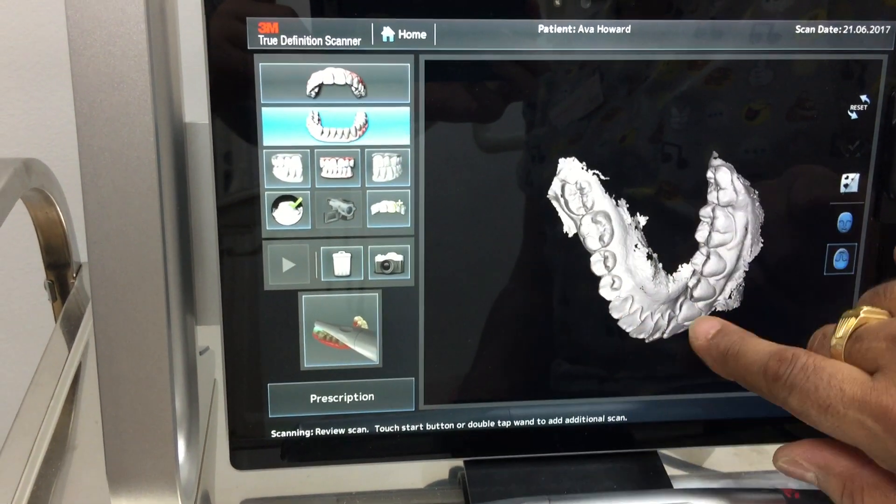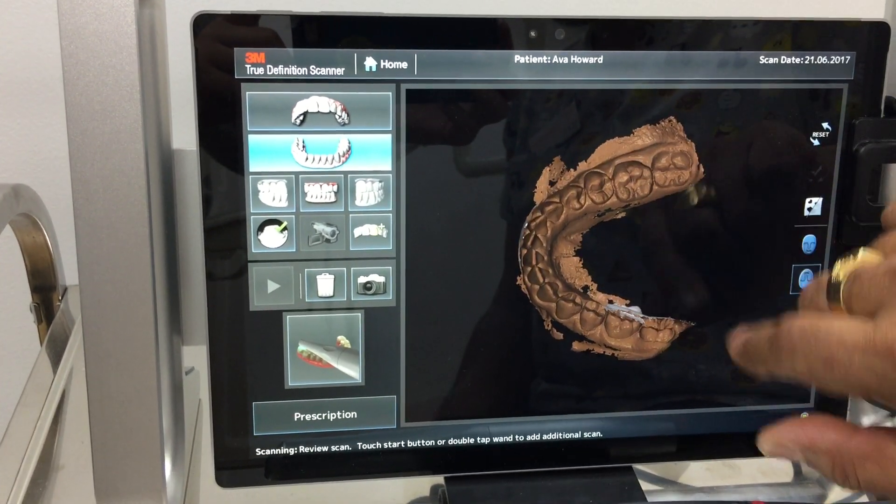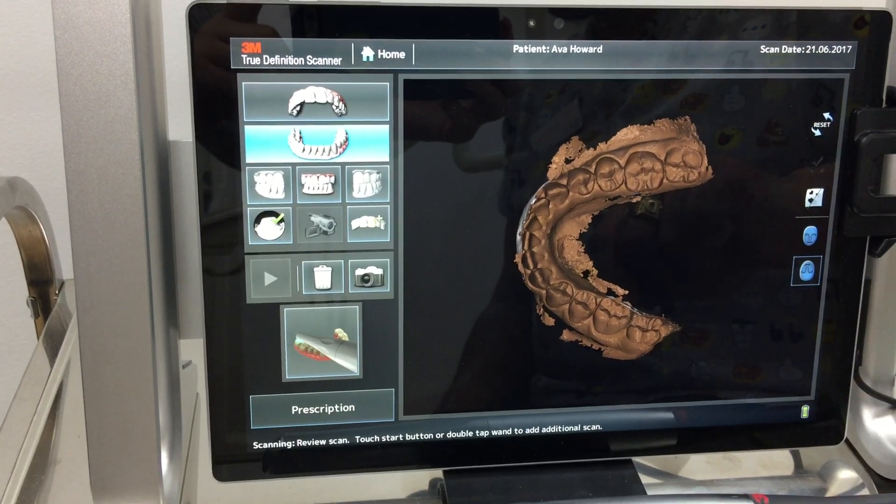This is the lower jaw. You can see we can look at it from all angles, and if you look under here, see how it looks brown or sort of a gold color.